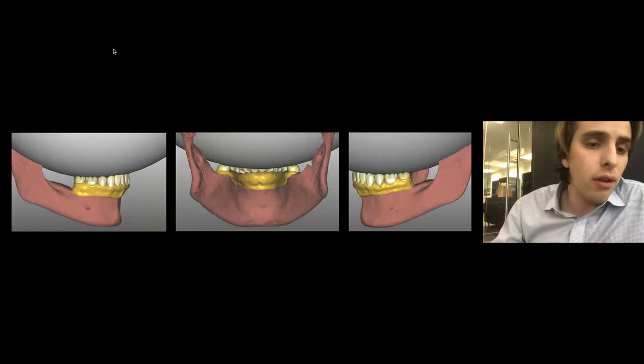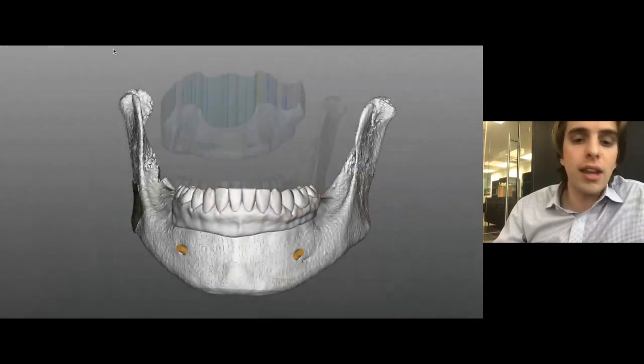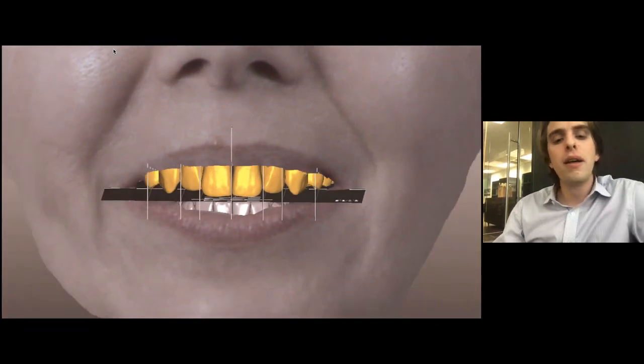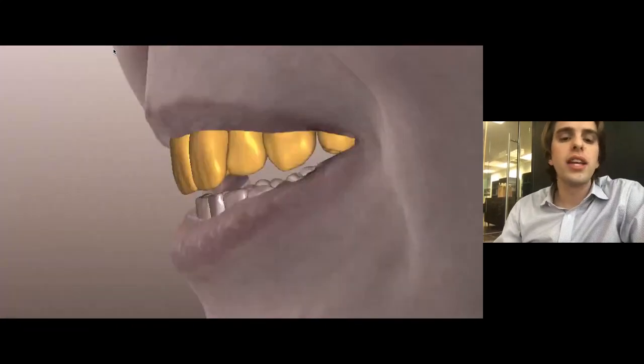We go to save this structure out, and we do the same for the upper jaw, this time with another set of references, the 3D face scans, and perhaps a golden proportion table split left and right for the deviations in the patient's individual occlusal plane. And we simply go to place the teeth functionally and aesthetically.